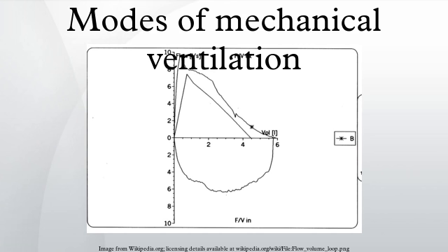Volume guarantee. Volume guarantee is an additional parameter available in many types of ventilators that allows the ventilator to change its inspiratory pressure setting to achieve a minimum tidal volume. This is utilized most often in neonatal patients who need a pressure-controlled mode with a consideration for volume control to minimize volutrauma. Spontaneous breathing and support settings.